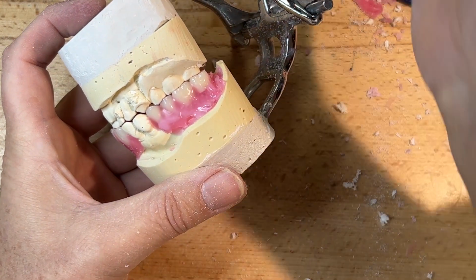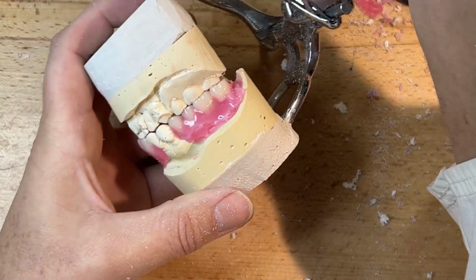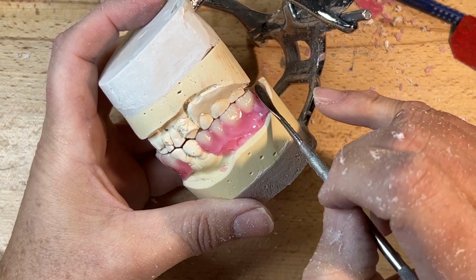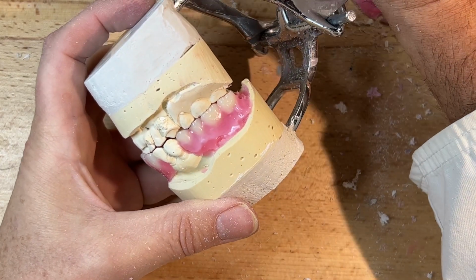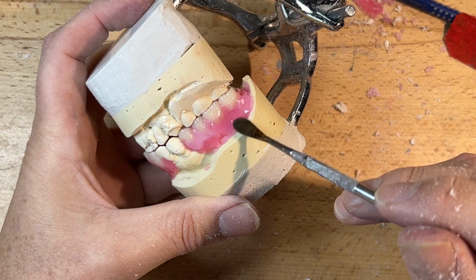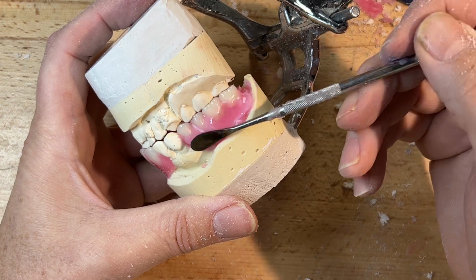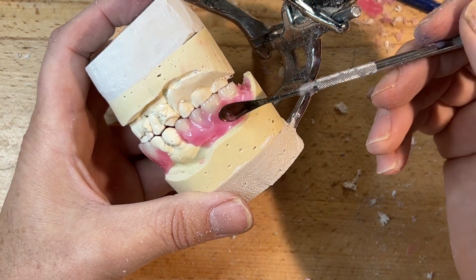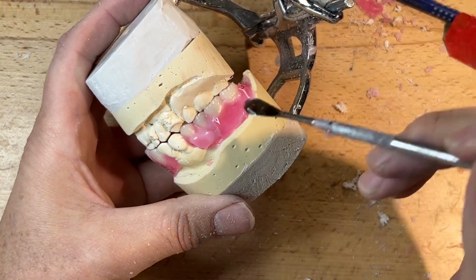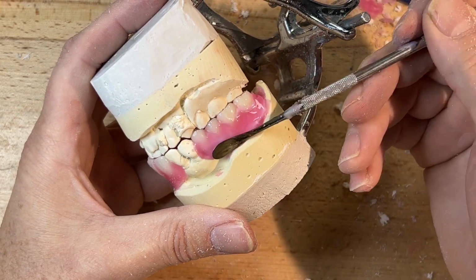Now this is a wax up for try-in, so the festooning will be pretty basic. And the reason is, if there's any adjustments to be made, the time we spent here excessively on festooning will be all for lost and all gone. If I was going straight to a finish, then I would have my wax up for finish. That doesn't mean we're gonna make a hasty wax up, a sloppy wax up. We're going to maintain the length of the prosthetic teeth as best we can to fit in with the existing dentition.